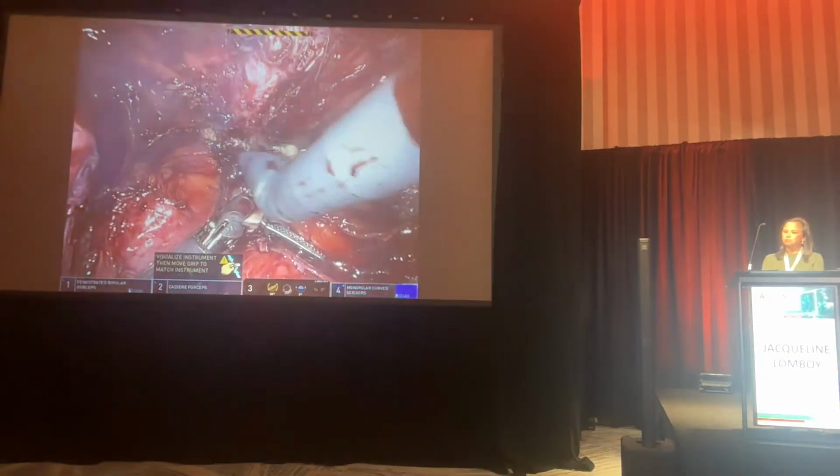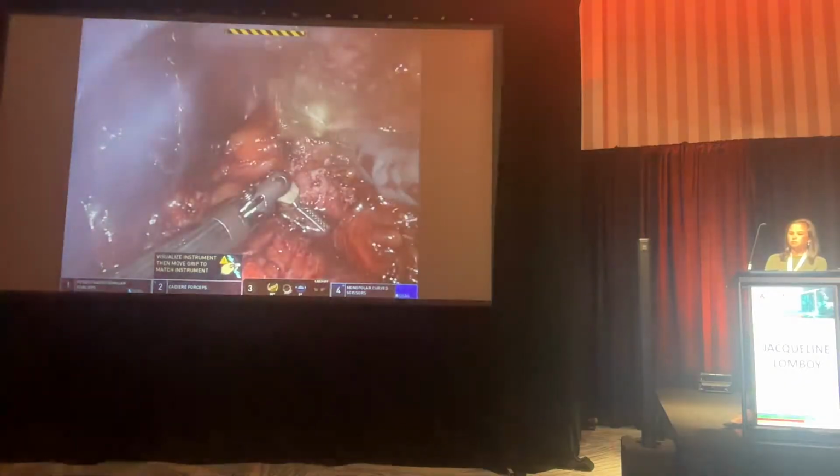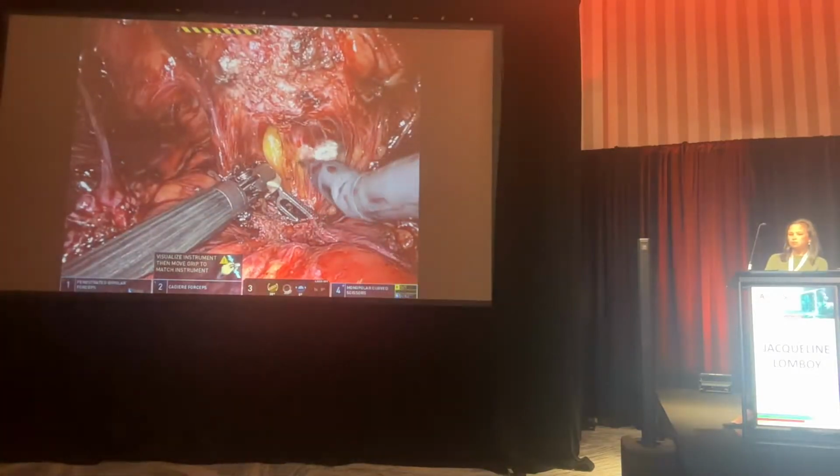Based on preoperative imaging and the anticipated size and depth of the nodule, sharp dissection through the nodule was necessary to reach the rectovaginal space. Therefore, a portion of the nodule was left on the uterine torus and the rectosigmoid bowel.